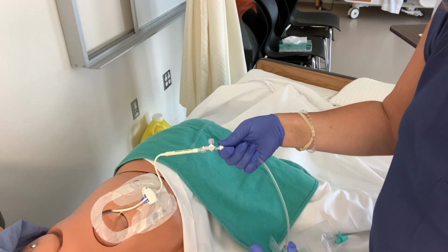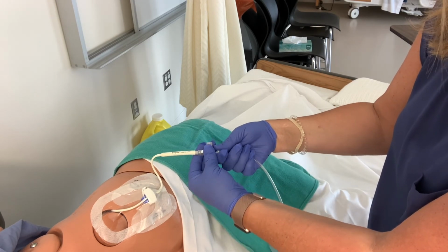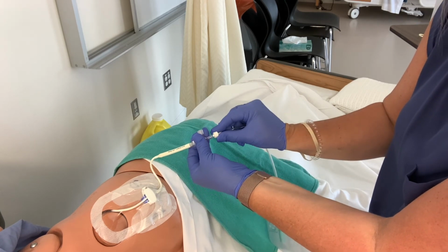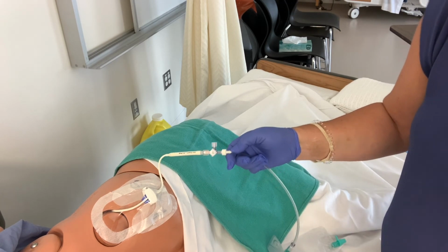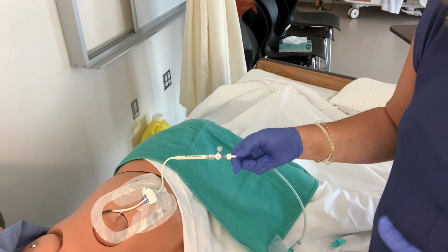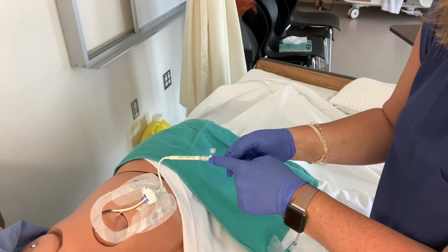Anytime I manipulate or use a stopcock, I always put my fingers right on the stopcock, because it allows me to take off the right device without removing the stopcock. In the package, when you go to do some of the changes, a new stopcock will be there, but we don't use it. We always leave the original stopcock on to the patient, okay?